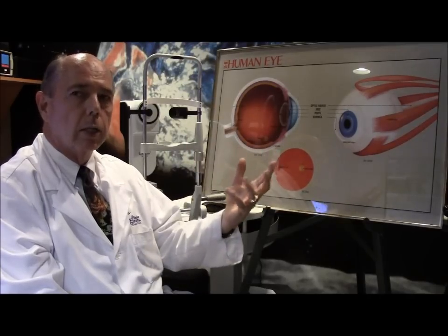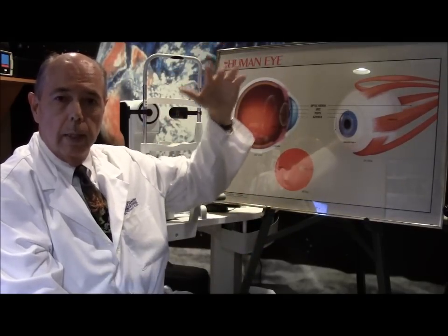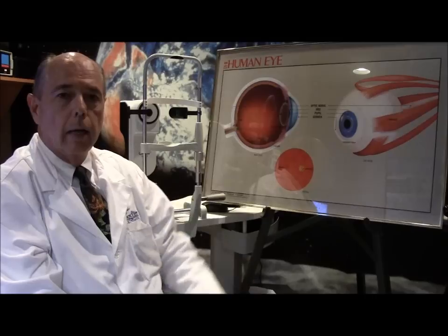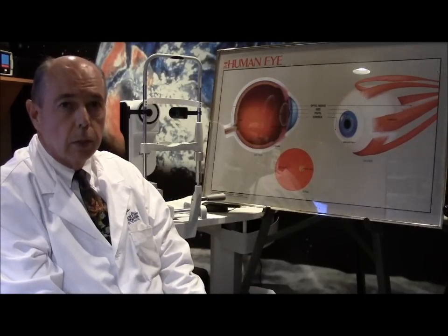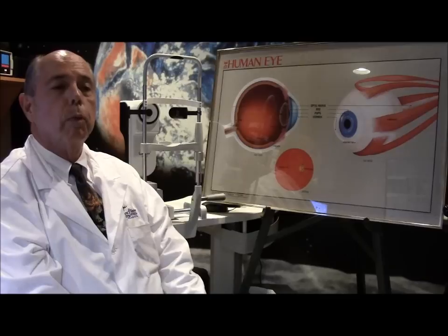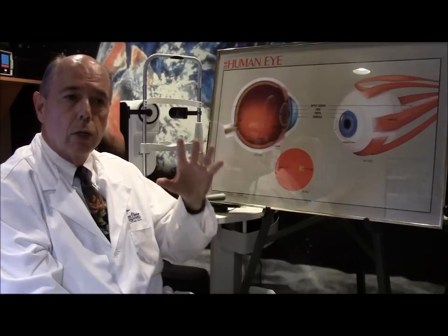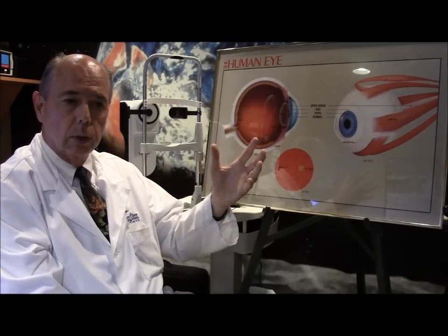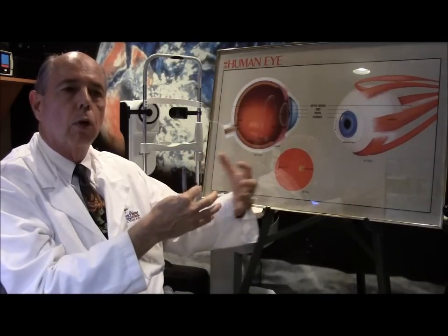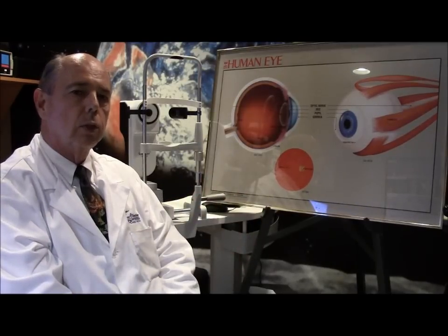We don't have perfect eyes and we don't have perfect vision. For example, an animal like a hawk flying high in the sky looking for a tiny mouse down in the grass has far better vision than we do — we would not be able to see that mouse. So the Tracy Technology machine measures those aberrations in your vision system, and that way we can come up with a lens that more closely matches what your own eye has in terms of its shape and the aberrations present.